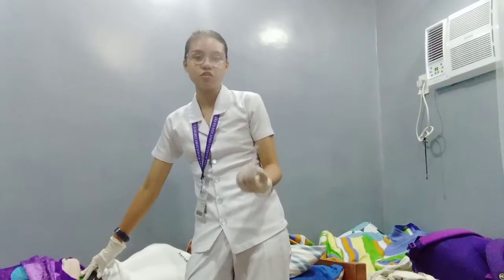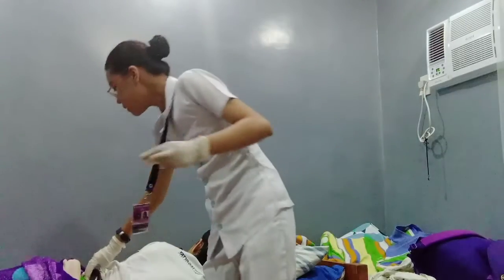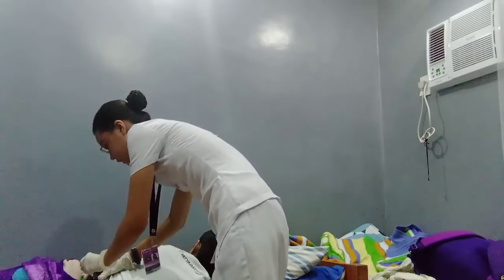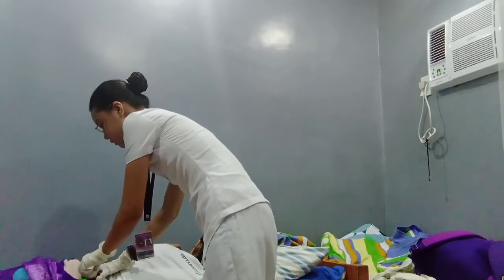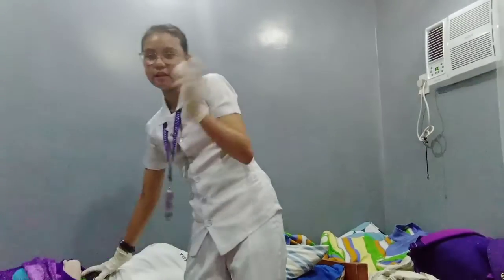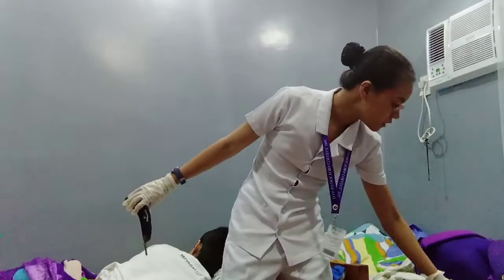Place the patient in a comfortable position. Again, since I don't have a gauze pad, I will be improvising by using a cotton ball with 70% alcohol, and then throw this in the bin. So afterwards, you need to cover the injection site again.